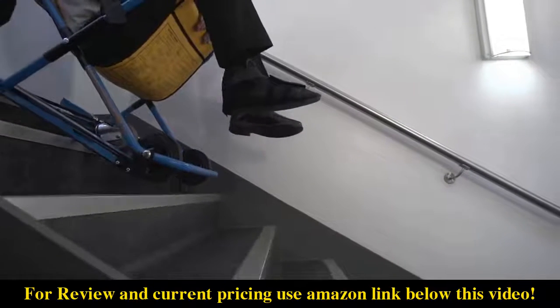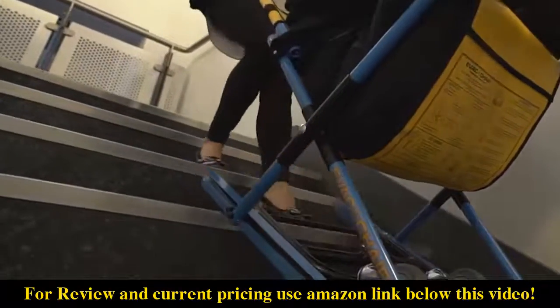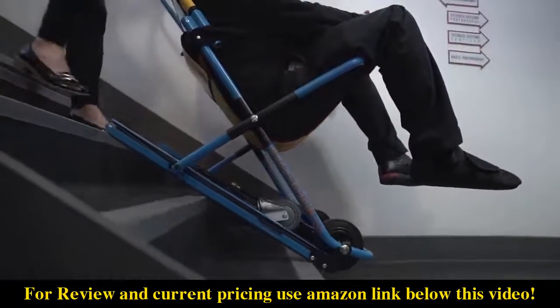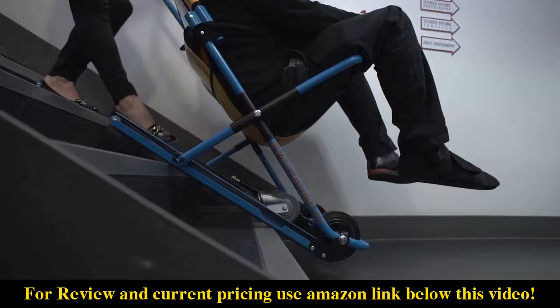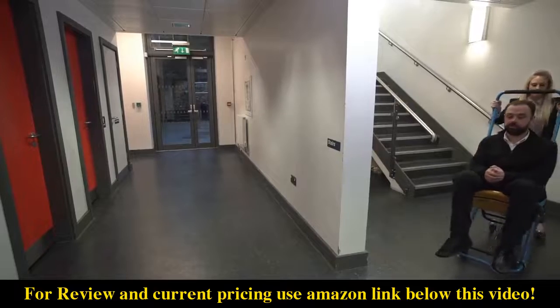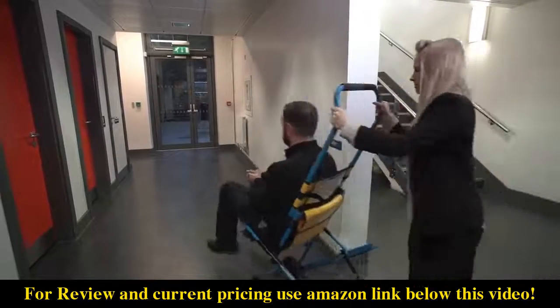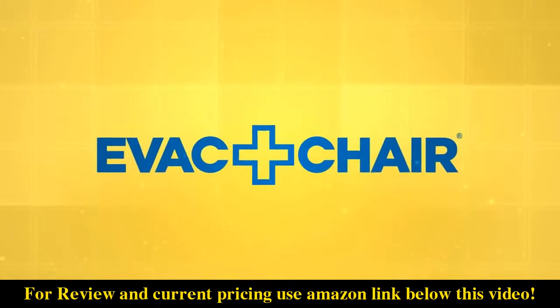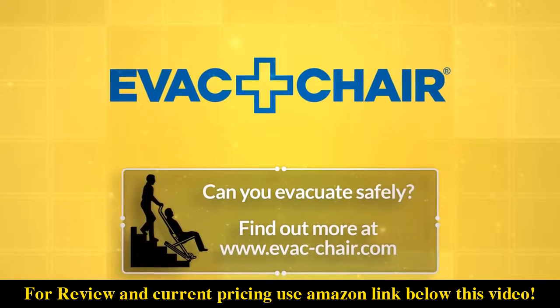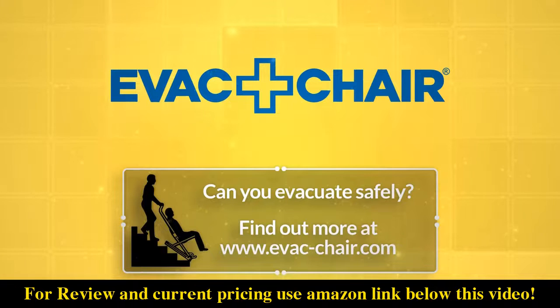When approaching a second flight of stairs, launch the chair again and push towards your feet to ensure the chair smoothly glides down the stairs. The EvacChair has specially designed tracks with EvacTrack technology that controls the weight of the passenger and speed of descent, enabling anyone to operate the chair. On a flat surface, lower the rear wheels so that it can be used as a temporary wheelchair. EvacChair ensures 100% customer satisfaction and never compromises on quality. All chairs come with a lifetime warranty and a competitive price guarantee. With hundreds of thousands of satisfied customers, EvacChair is the world's number one stairway evacuation chair.